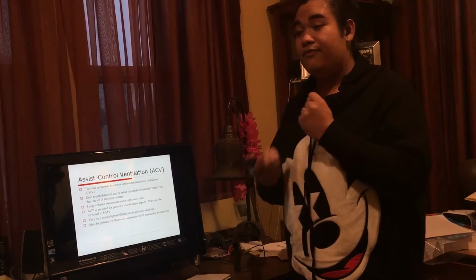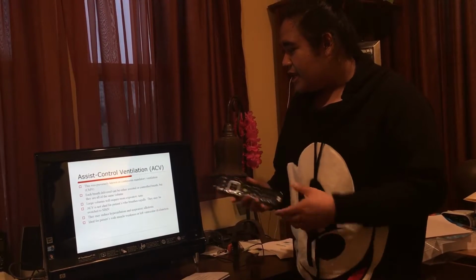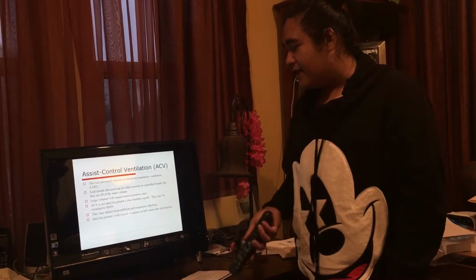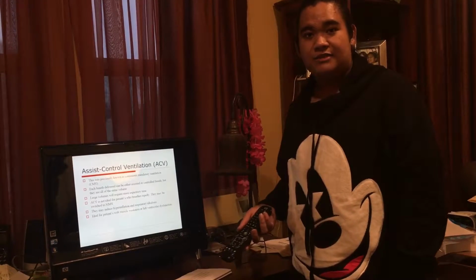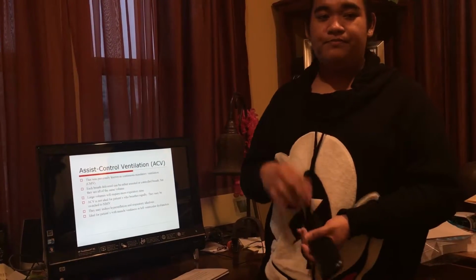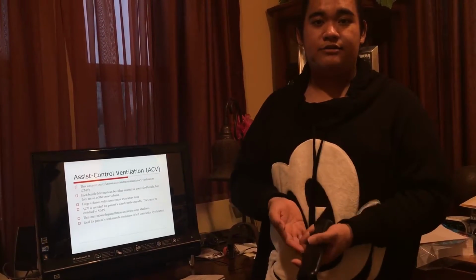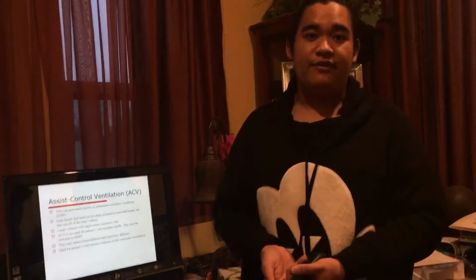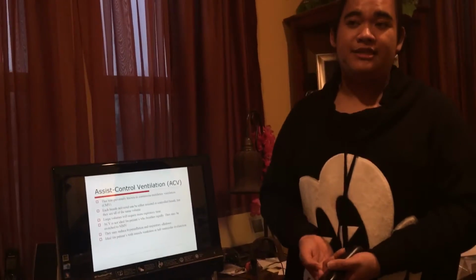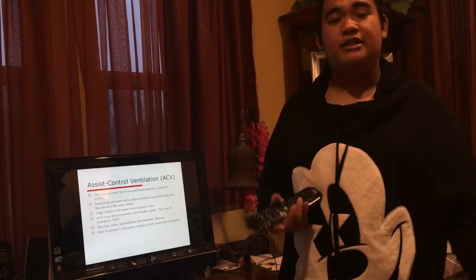If we don't do that, as it says in here, it could induce hyperinflation and respiratory alkalosis, because we have too much oxygen inside. We are trying to prevent lung injuries, or in this case, hyperinflation. So we need to set more expiratory time rather than inspiratory.